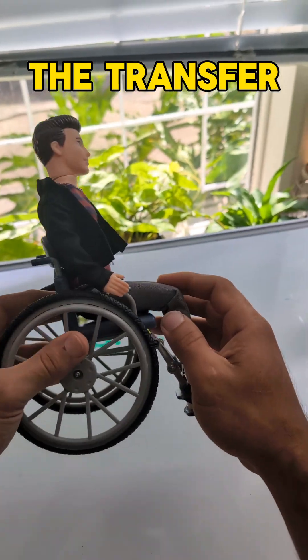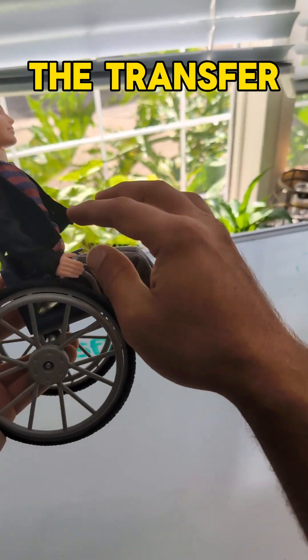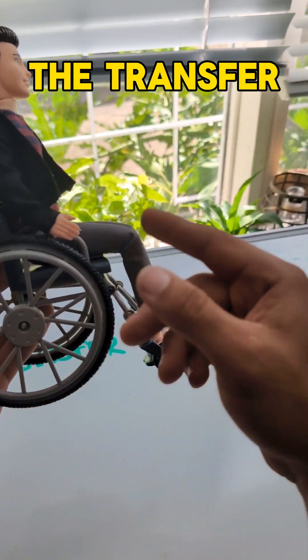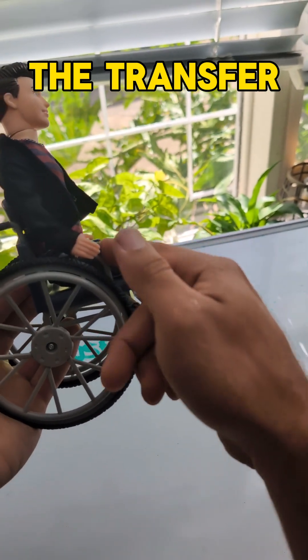This could be either because you're hoist transferring or stand transferring — whatever the reason is that the bottom doesn't go all the way back into the chair. It sort of lands halfway through, so we start off at a really bad place when we sit in this position.